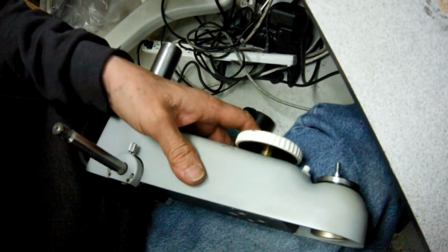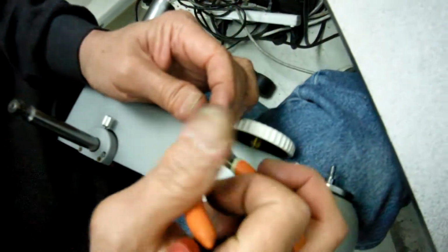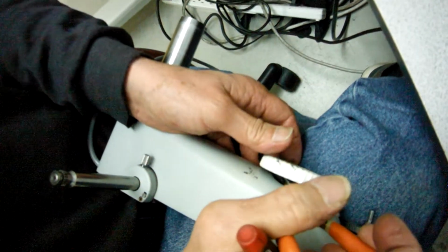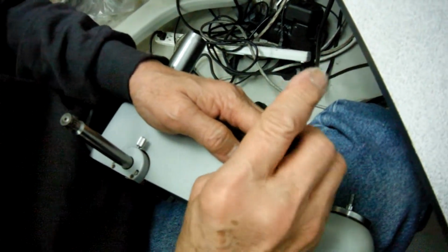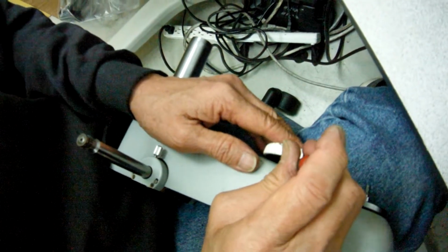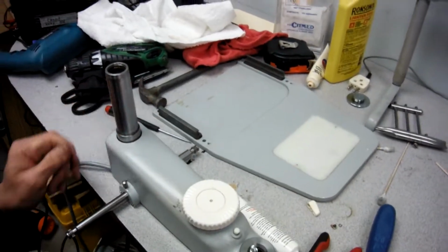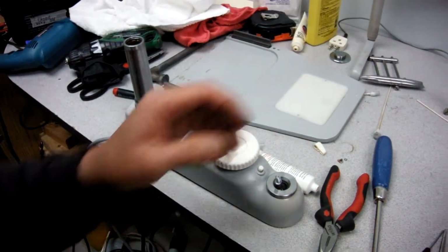Okay, right now they're all flat, so that's good. But somehow you need to have pliers to hold the worm gear, or the screw with the gear there, and screw the elevation knob back in place. After it goes all the way in, then you can lock the set screw right here. You don't have to overtighten this set screw. You just bring it in tight and then give it a hinge. And that's all you've got to do about the elevation knob.